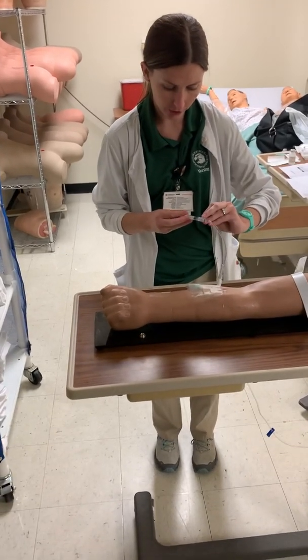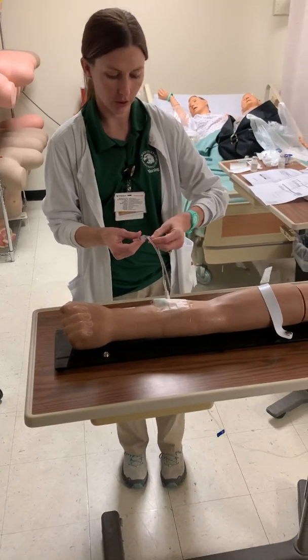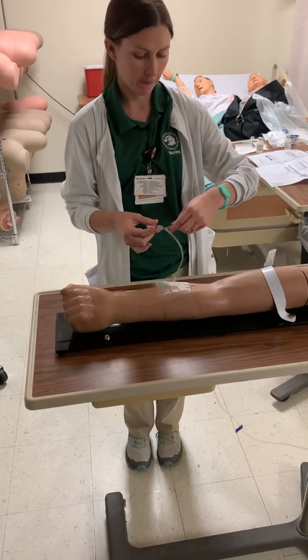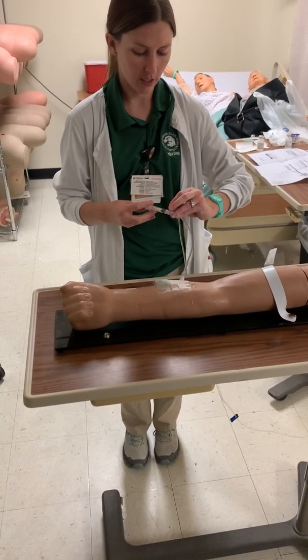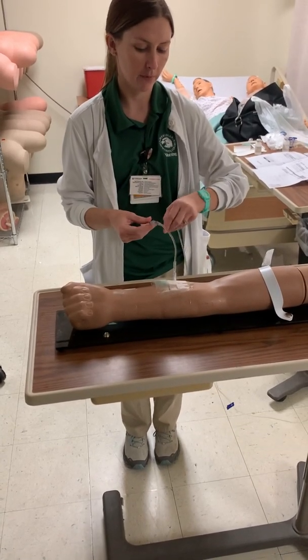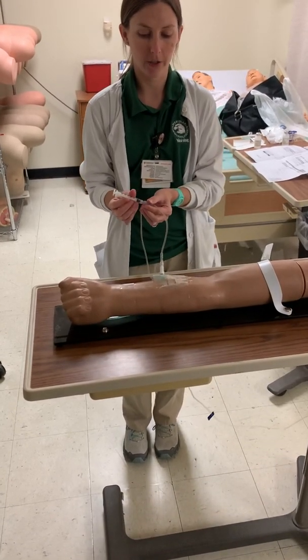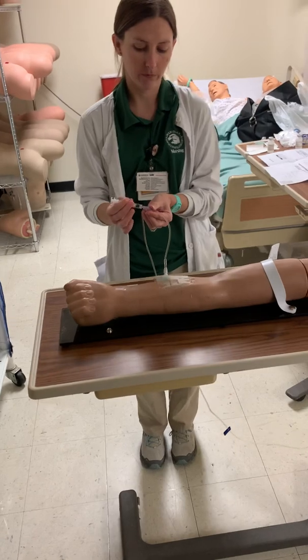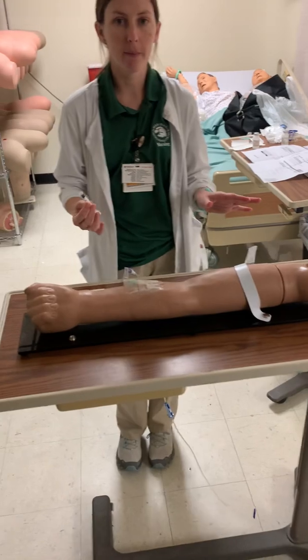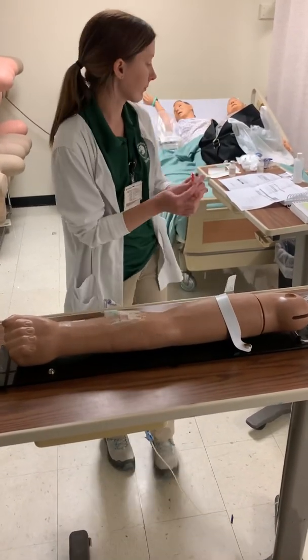clamp, push another 1, 2, 3, 4. Unclamp, let it flush, wait another full minute. I would clamp, and then I would push my last 0.4. And then I would open it up and let it flush. Okay, the whole time I'm pushing the medication, I'm monitoring my patient, making sure they're not experiencing any side effects of the medication. When I'm finished pushing my medication, I want to make sure to discard in the sharps container.